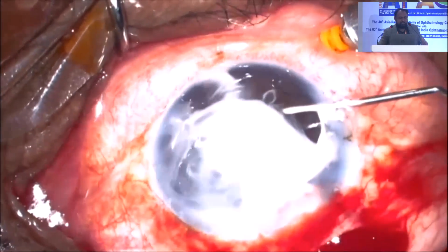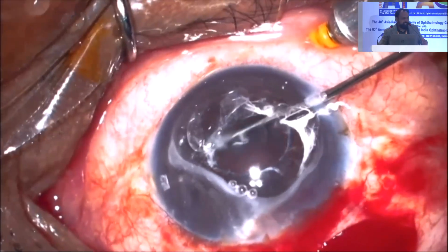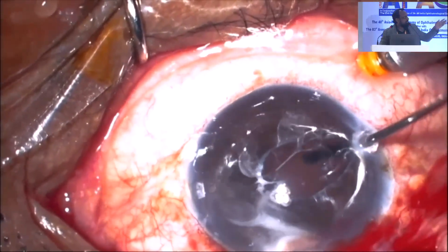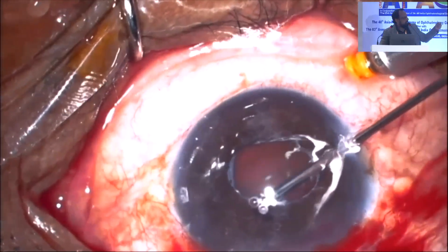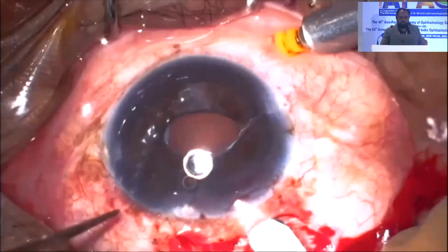Once you stain, I always prefer to stain and wash it. You can see the amount of vitreous strands. Even though it didn't look like it at the start of the case, it looked like a round pupil and all was good, once you stain, you see the vitreous. So you can use a side port. In this case I've used the trocar, but you can use an AC maintainer or have the infusion through your side port, and the 23 gauge or 20 gauge cutter that comes with most phaco machines.